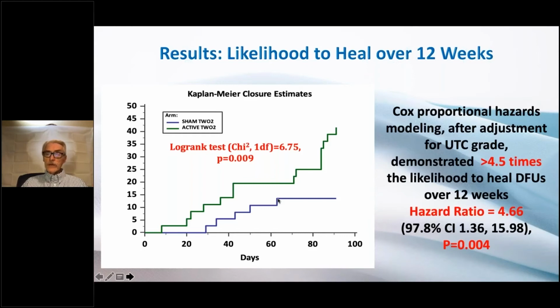And I think this really tells you the story. There is indeed a signal starting as early as 14 or 20 or 21 days that just moves on entirely through the treatment period, and the groups don't cross. So this was significant, as you see here by the log rank test. More data to support a very positive effect of this multimodality therapy.